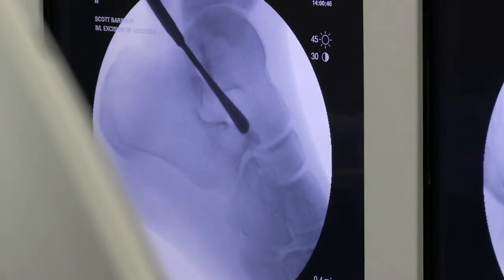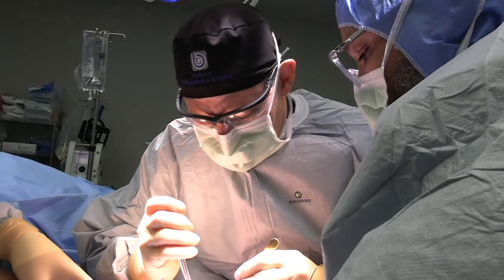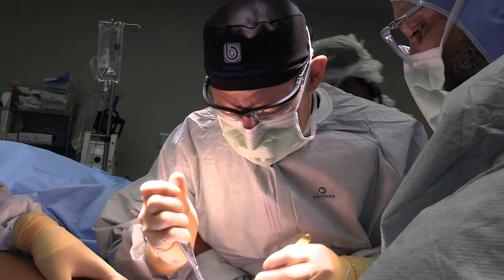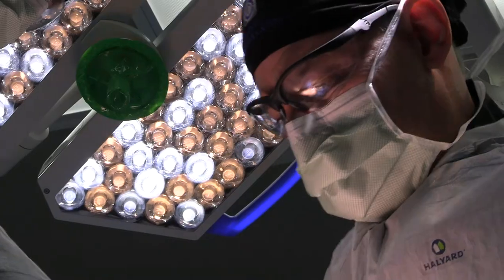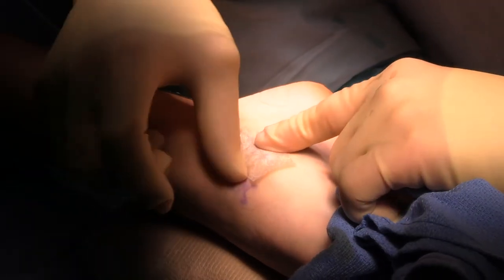You can see that one not as well because it's hiding behind the calcaneus. Part of the attachment is on the bone, the navicular. We're just sort of shelling out this part of the bone on the inside of the tendon. And then when we repair the tendon at the end, it'll heal. Some people, the bones don't fuse and they're left with a little piece called an accessory navicular, which in most cases is not painful — it's just a difference.